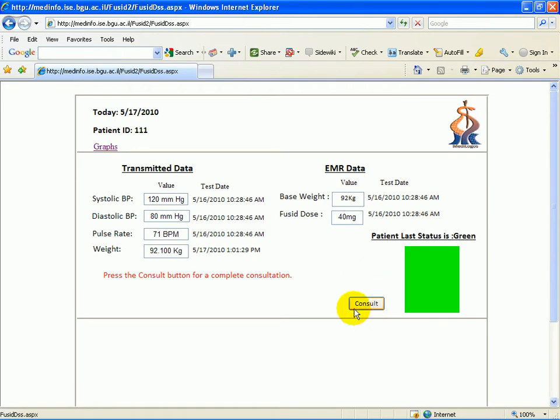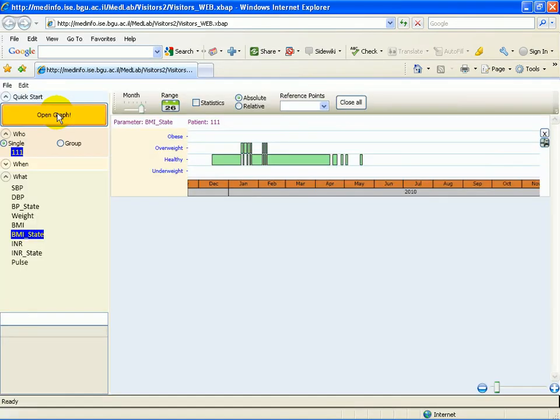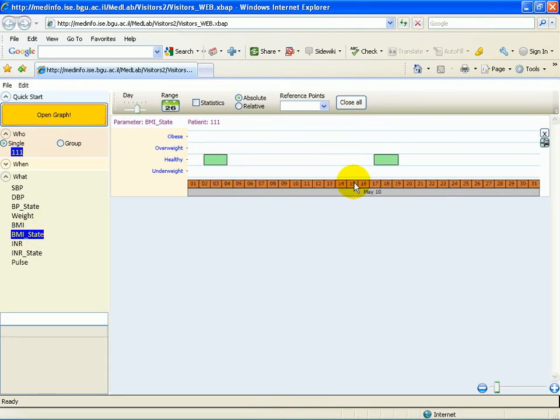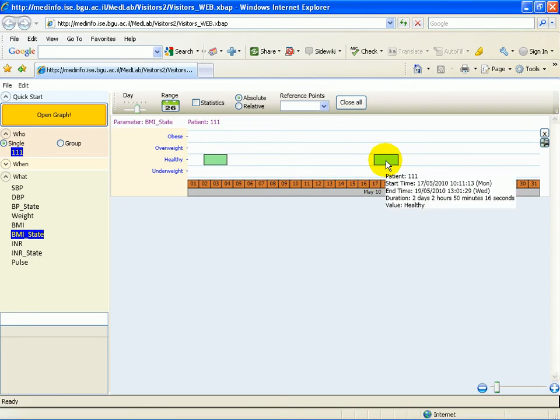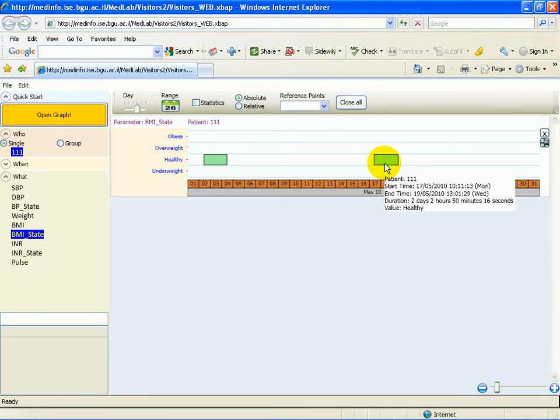Before we continue on to the consulting session, we wish to demonstrate how our graphical system represents the data in its medical concept state. Our visualization system has the ability to convert raw medical data into the correct medical concept. We have converted BMI into the medical concepts relevant to the clinicians, and our patient is in a healthy state as per the relevant medical concept.